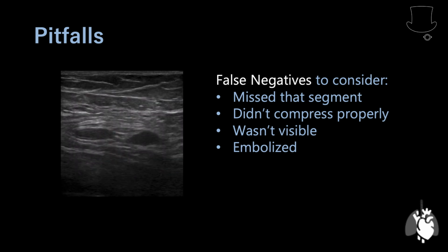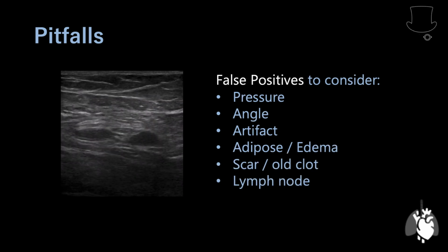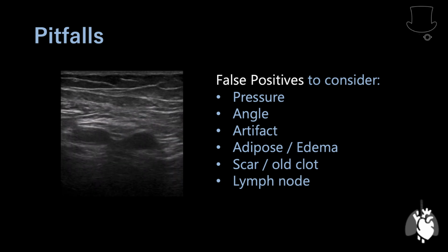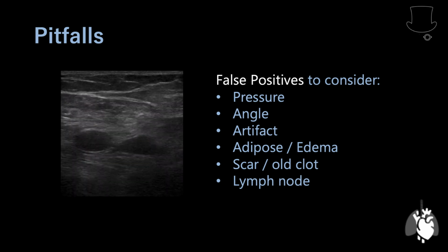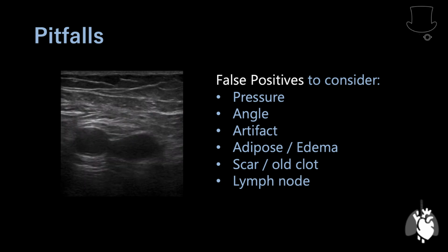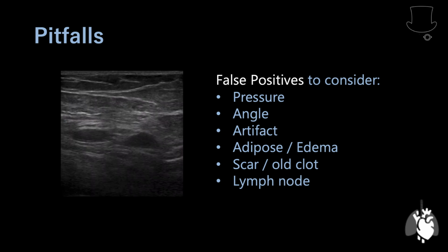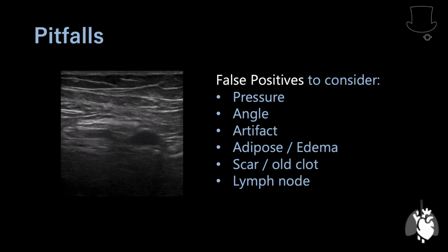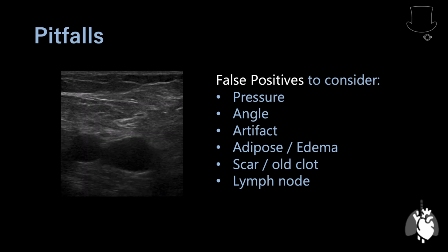The likelihood ratios are not the same as for diagnostic imaging. I should also mention that compression ultrasound can only evaluate compressible vessels, which does not include the iliac veins or the IVC. These sites are important considerations in postoperative and pregnant patients. They can be evaluated with advanced spectral Doppler and augmentation techniques that could be part of a special training program, but would be included with a comprehensive diagnostic study.